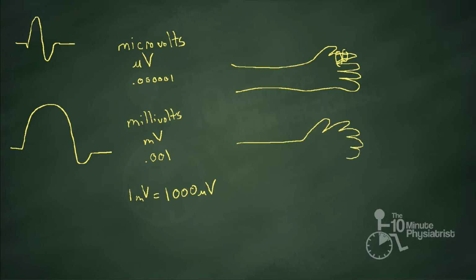In a motor conduction study, I think that's 6 fingers, but we'll go with that. This is my abductor pollicis brevis, and I'm going to pick up over the muscle. The entire muscle is an electrically active membrane. The entire electrically active membrane generates an action potential. It's a relatively huge structure compared to the little digital nerve we're measuring for the sensory nerve action potential. Therefore, a very tiny microvolt potential compared to a very large millivolt potential.